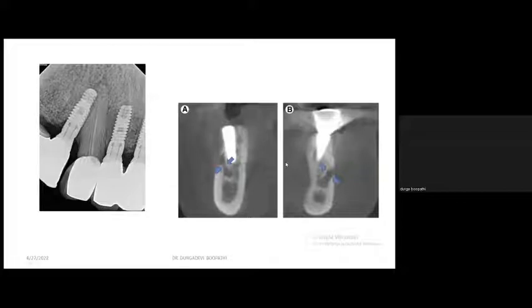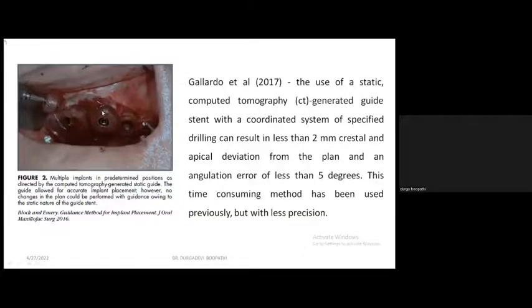This is the static navigation that I was talking about. This is the stent that is prepared. And these will be the surgical guides, so the implant is placed exactly in the same position. And this cannot be changed during the time of surgery.